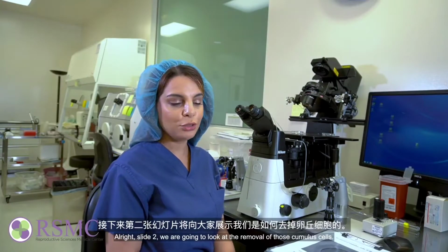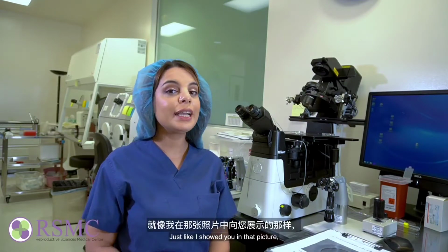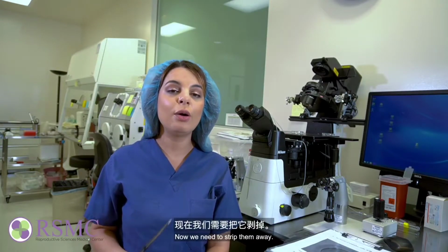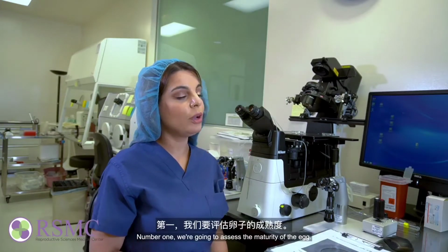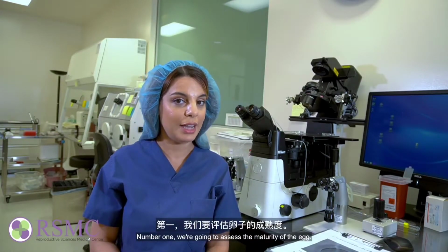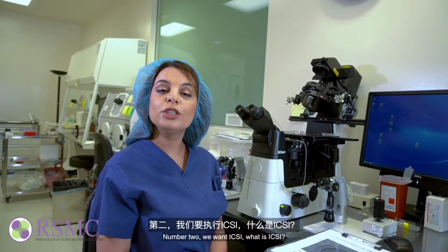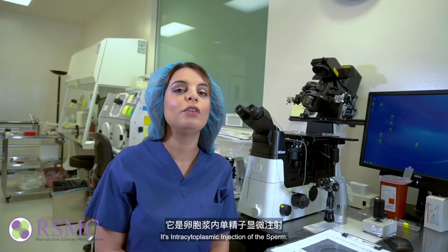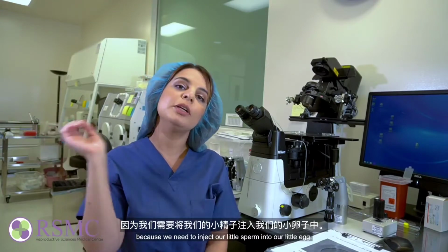Alright, slide number 2, we're going to be looking at the removal of those cumulus cells. Just like I showed you in that picture, there was the egg surrounded by the cumulus cells. Now we need to strip them away. So we can do two things. Number 1, we're going to assess the maturity of the egg. And I will show you a picture and explain further in a minute. Number 2, we want to ICSI. What is ICSI? It's intracytoplasmic injection of the sperm. So we cannot have those cells clumping there because we need to inject our little sperm into our little egg.